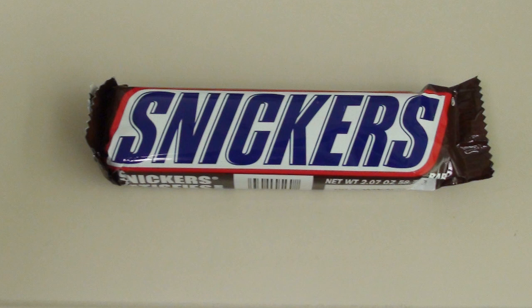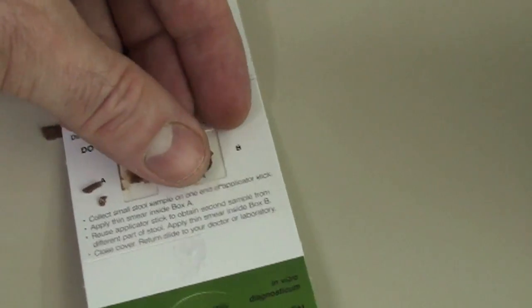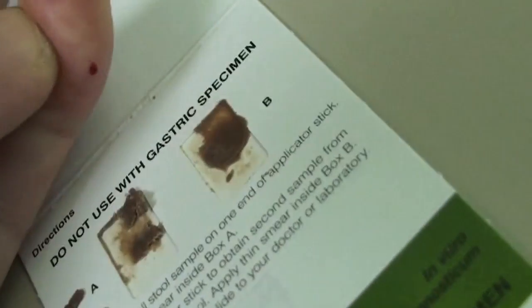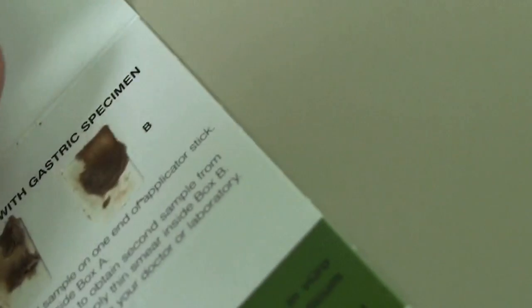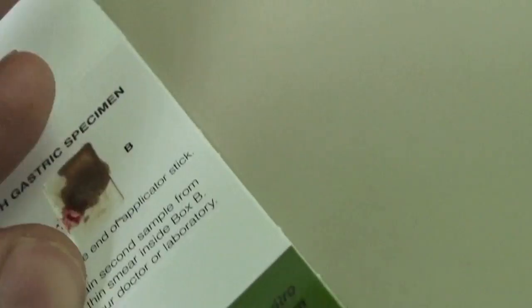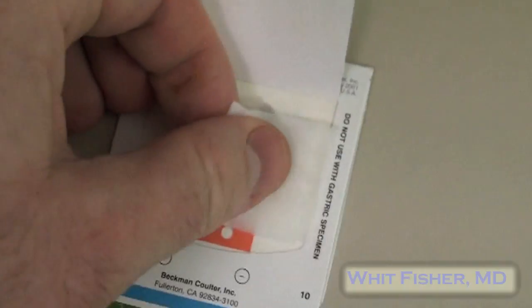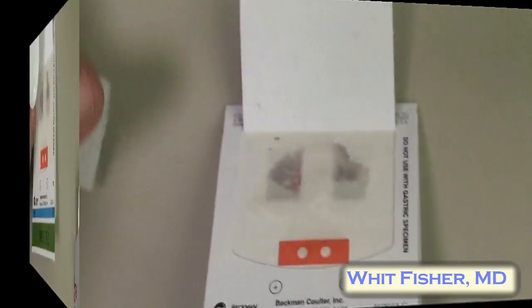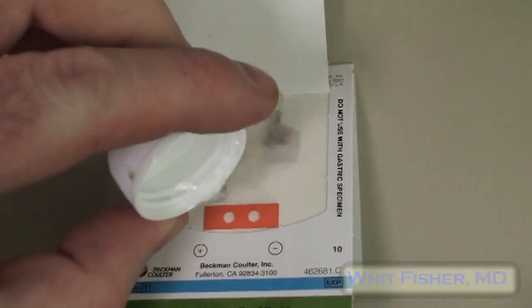Here I have some foul, repulsive, simulated fecal matter. As a tormented and dedicated educator, I'm applying my own blood to one of these specimens just to teach you. I hope you appreciate it. Okay, so now rub an alcohol prep on both samples briefly, then splash a little hydrogen peroxide on top.